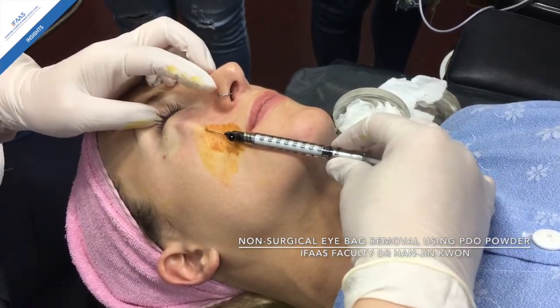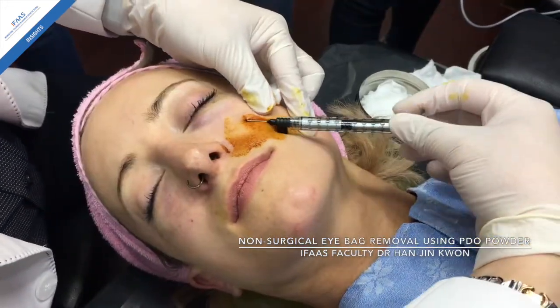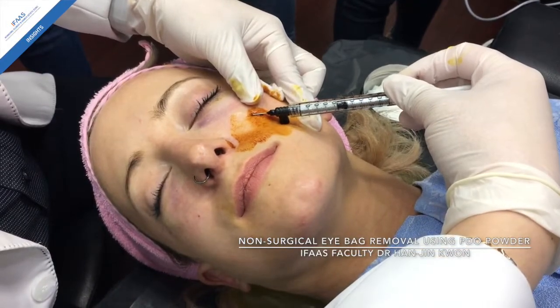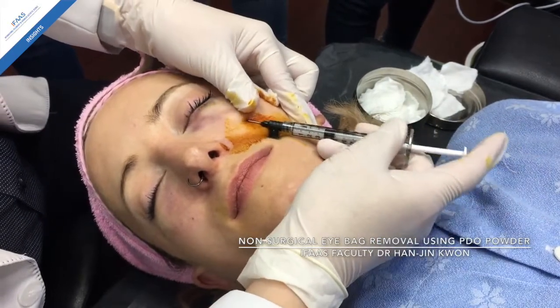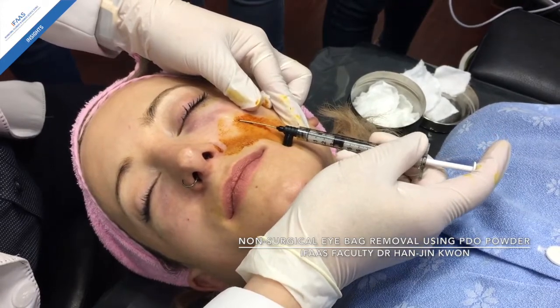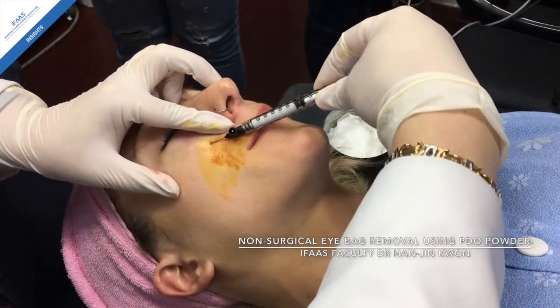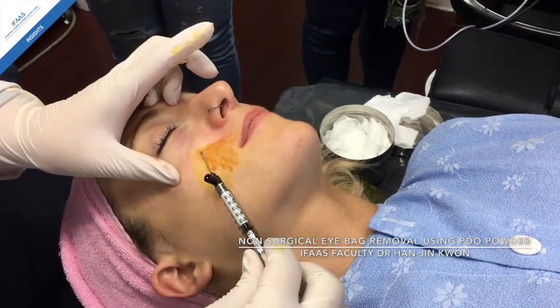Even if you hit here, no problem — this will never puncture the eyeball because it's a blunt cannula. You have to go up to here. If you stop before that, you create a lump or protrusion. You have to go all the way up to the lower end. Okay, just a little bit, then finish.